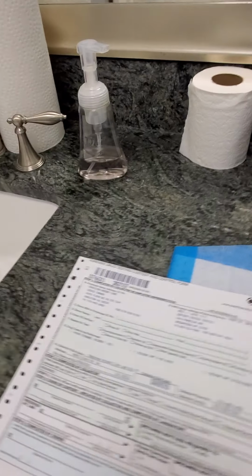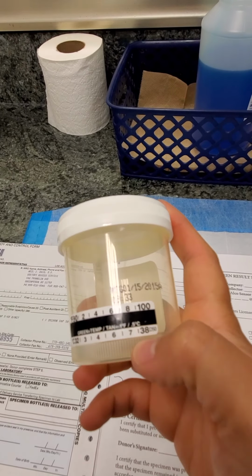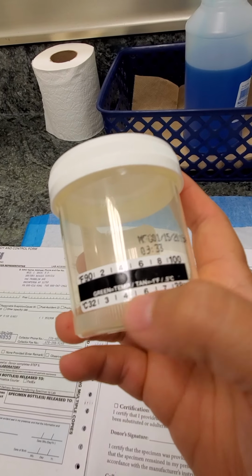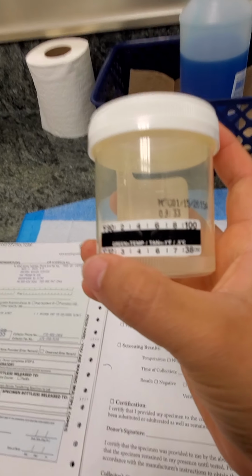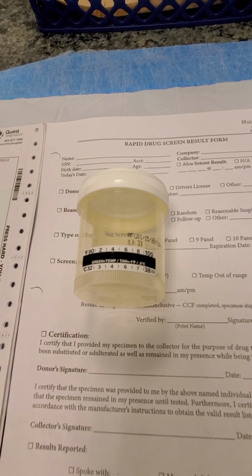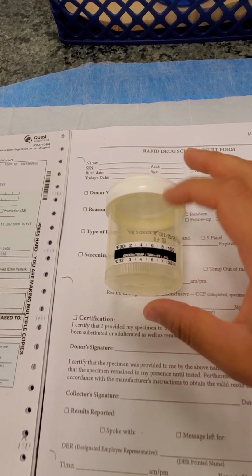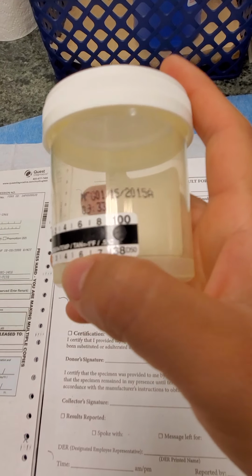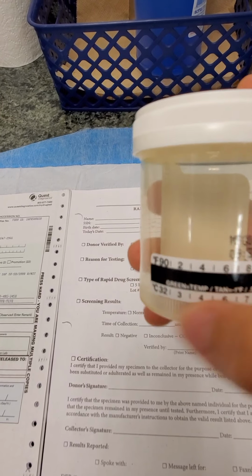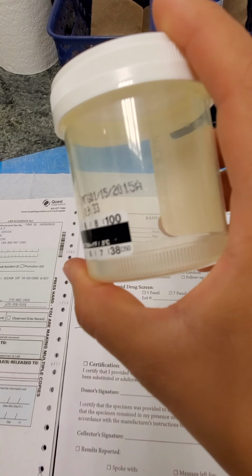While they're washing their hands, you want to make sure that you check your temperature strip. There should be a temperature on here. It should be a little green dot. Let's see if my camera can focus. There should be a little green dot, and it tells you right here, green equals the temperature. If there is a tan dot on here, that means that it's one degree less. So you should see a green dot from the 90 all the way up to the 100.